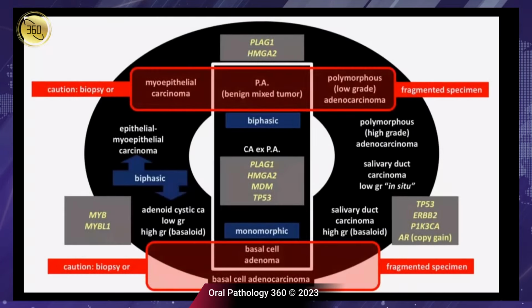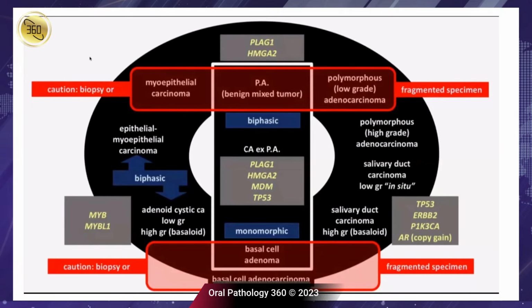And so what I attempted to do is put all of this complicated stuff together. Somebody said this looks like an old record. So, here's the record. What I tried to tell my residents is that in small biopsies or fragmented specimens, we may have trouble teasing out some of these myoepithelial or biphasic tumors, right? Because all of these tumors can have mucinous components. All these tumors can have an epithelial or a myoepithelial component. And the same is true for basaloid tumors.